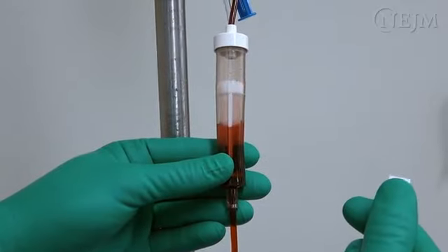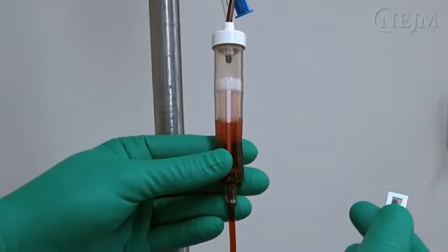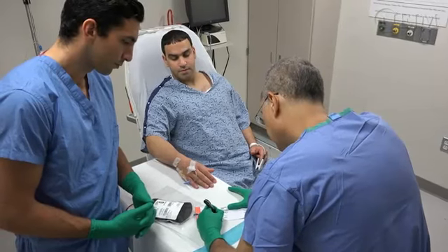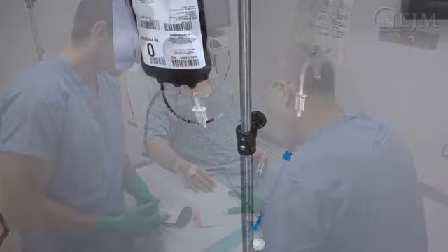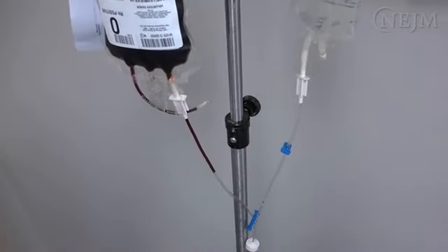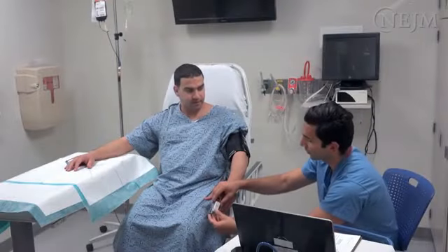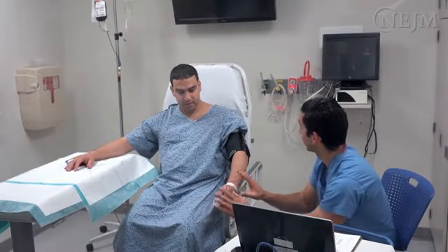Blood transfusion is a common and relatively safe procedure. However, serious transfusion reactions can occur even when adhering to the recommended guidelines. Clinicians must be familiar with the indications for transfusion, the equipment required for the procedure, and the complications that may arise from this potentially life-saving therapy.